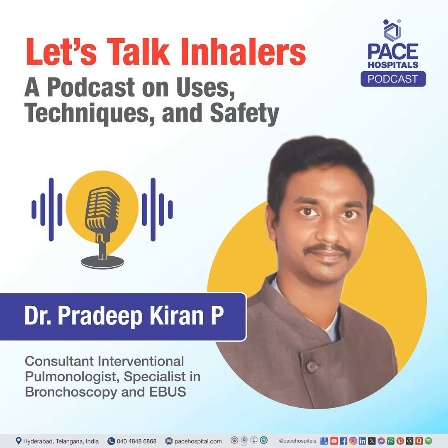Now you have to breathe in through your mouthpiece. Once it is pressed, you can breathe in through your mouth through this device mouthpiece, and then wait for 1 to 2 seconds and then release your breath through your nostril. That's how the drug enters into your airways. Before starting this also, we have to exhale or breathe out most of the air.